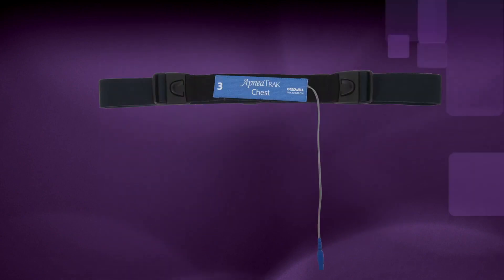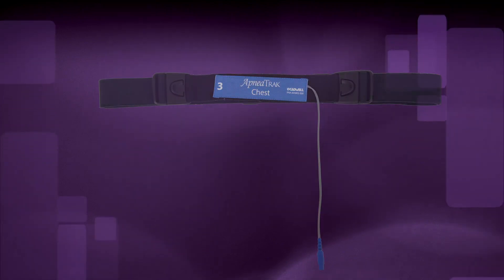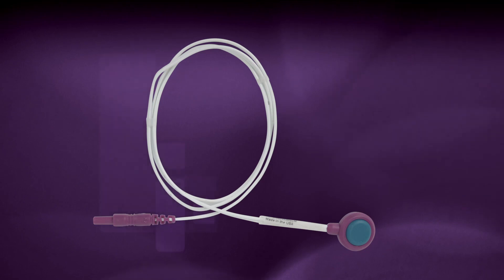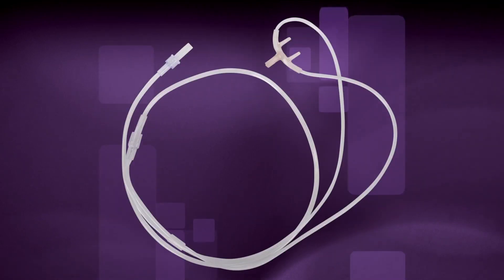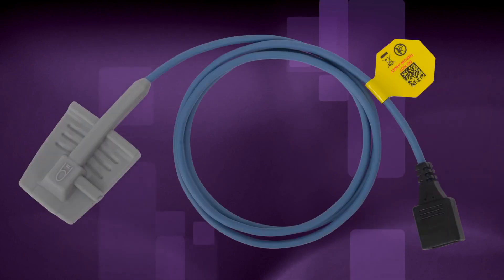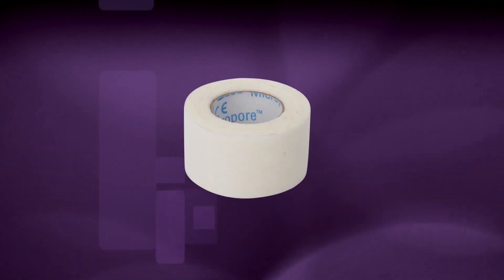A chest effort belt with a blue connector. An abdomen effort belt with a yellow connector. A snore sensor cable with a purple input and a purple disc sensor. An airflow cannula with clear tubing. An airflow sensor cable with a light gray input and a T-shaped sensor. An oximeter finger sensor. Adhesive tape. And the patient instruction manual.